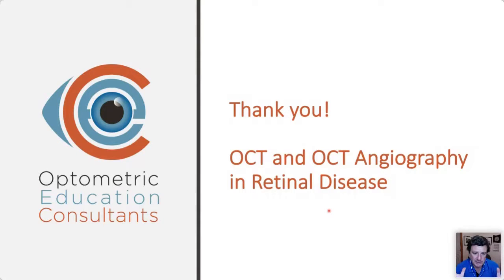I understand that there's a lot of people listening. We're not price fixing out there, so I can talk about prices. I'm not telling you what to charge. So to answer your question, we do charge a little bit more for the angiography. Greg, are you finding these subtle findings in patients who are paid for the wellness program? Because they look fine until you look. So it's hard to substantiate the scan in the first place.